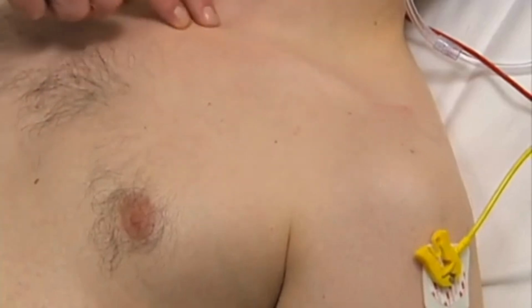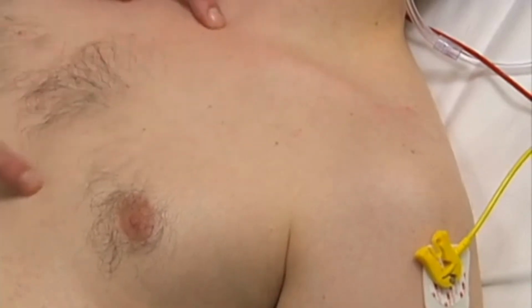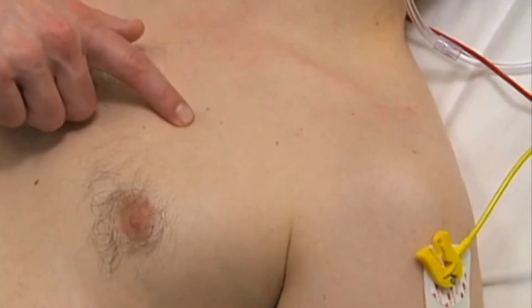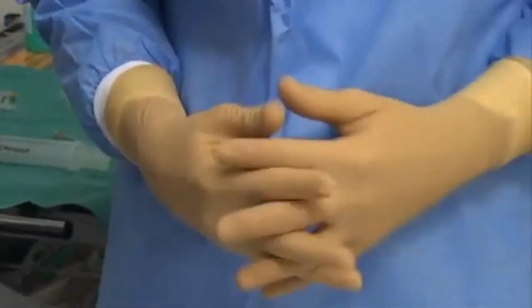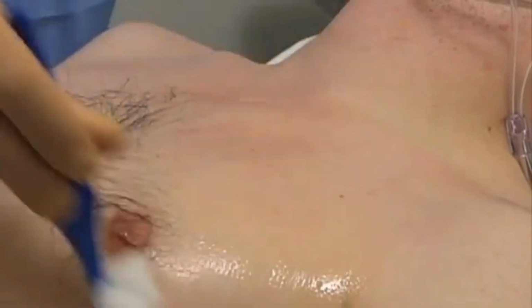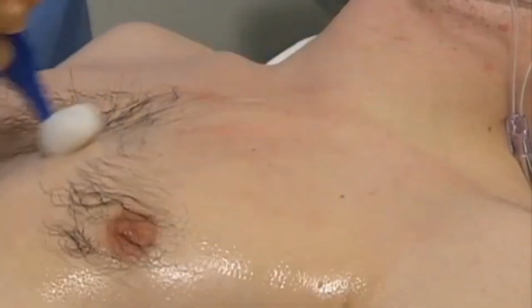Next, identify the middle of the clavicle and the midclavicular line. The intersection of the midclavicular line and the second intercostal space is the correct place to insert the needle for aspiration of pneumothorax. It can be helpful to mark the needle insertion site with a skin marking pen. Use chlorhexidine or another antiseptic solution to clean the patient's skin in the area where the aspiration will be performed, and position the sterile drape.